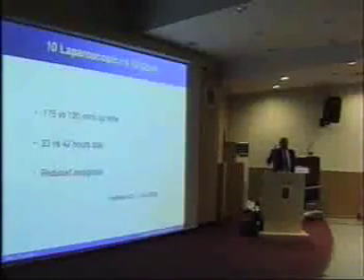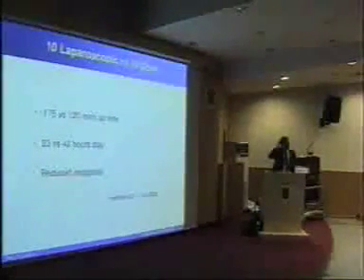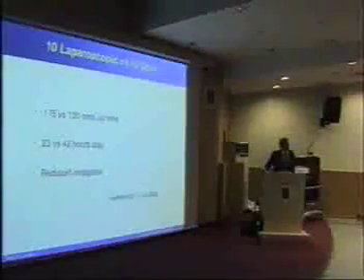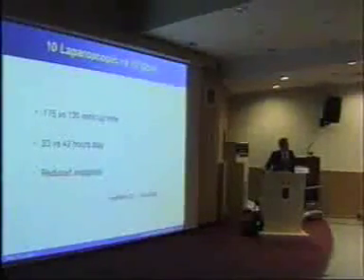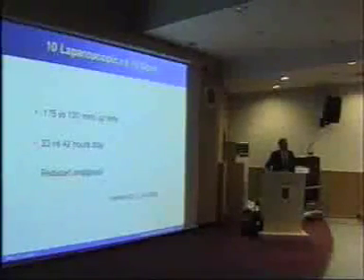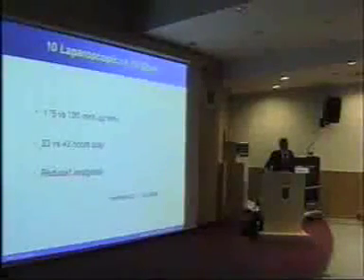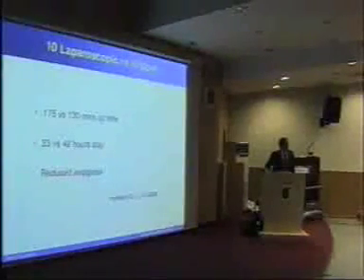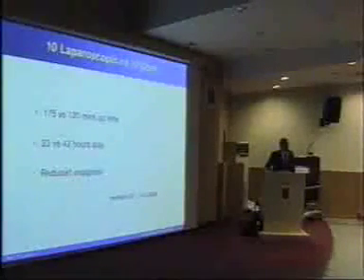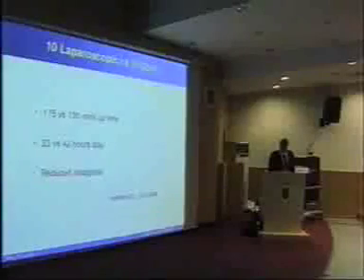There is more time when you do it laparoscopically, and it's really important to give yourself plenty of time. So if you're going to do a laparoscopic nephrectomy, give yourself a whole day. Give yourself a fit patient, a relatively simple case, and plenty of time, so that you maximise your learning and can relax about other factors. There's nothing worse than having the theatre administrators coming in and telling you, because you're taking a little bit longer, that you're going to have to cancel 4 cases. That's really very, very stressful. So you've got to give yourself a fairly stress-free environment, hopefully with the support of a colleague who's familiar with laparoscopy, and just take your time. I found in that situation, even the difficult ones work out okay. It's when someone's breathing down your neck telling you to finish because there are 3 more cases to do that things really get bad. So don't do that to yourself. Be quite prepared to take a lot longer than 175 minutes if you need to.